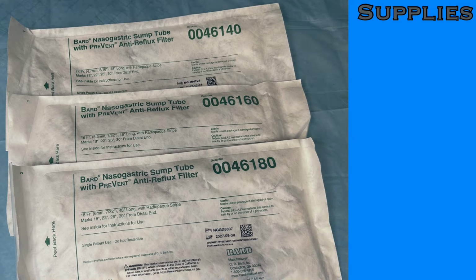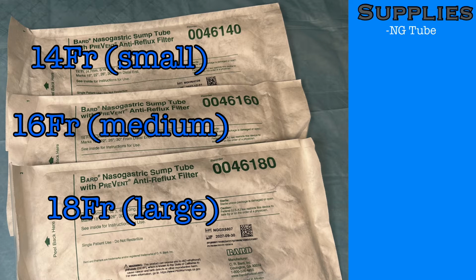Now that we know the device, let's take a look at the other supplies you'll need in order to place an NG tube. You'll need to determine the appropriate size of the NG tube. It may be in the physician order, or you may need to choose. There are many factors that will determine appropriate size, but always take into account the size of the patient's nare and the purpose of the NG tube, and that will give you a place to start when determining if you need a smaller or larger tube.